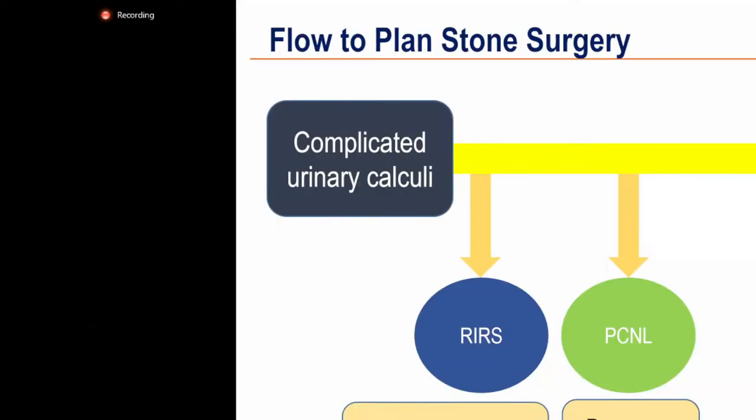So for treatment of complicated urinary calculi, I normally plan what type of surgery would be the first initial option for my patients. For small and multiple stones, RIRS first. For big stones, a miniaturized PCNL and RIRS as the next option. But when should we consider a bidirectional combined approach of antegrade and retrograde? It may mean the initial bidirectional approach to the target or intraoperative conversion of the surgical methods. And it is important to surgeons and our assistants and our nurses as well.